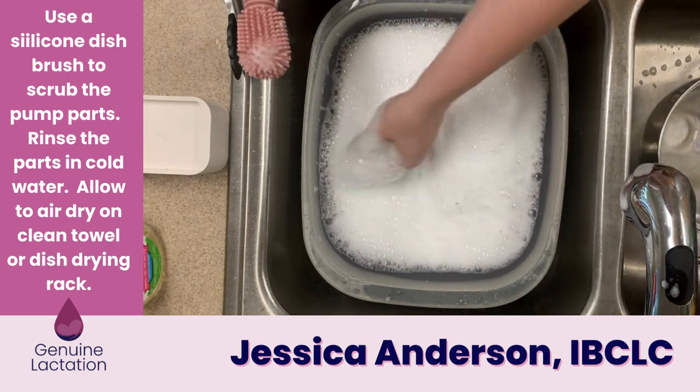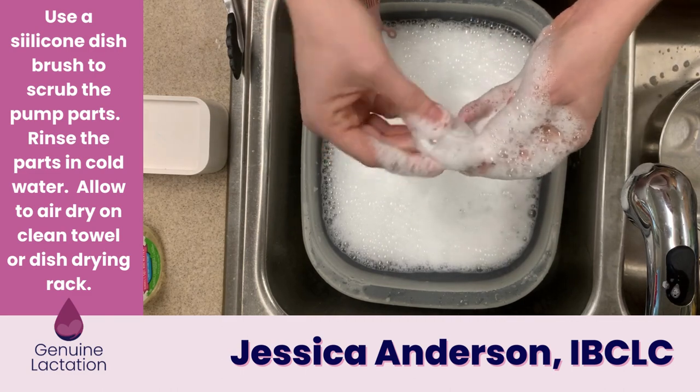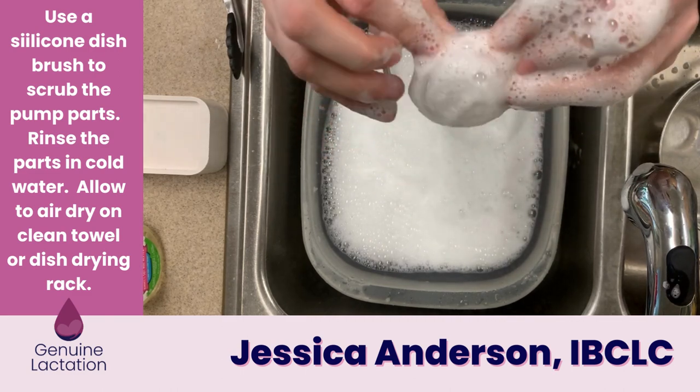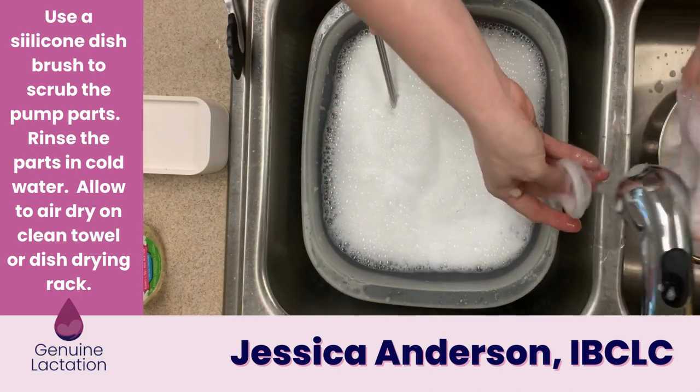When washing silicone parts, make sure you're getting into all the grooves. For example, this backflow protector has a little groove around the back, so you'll want to make sure you get into all those grooves before rinsing.